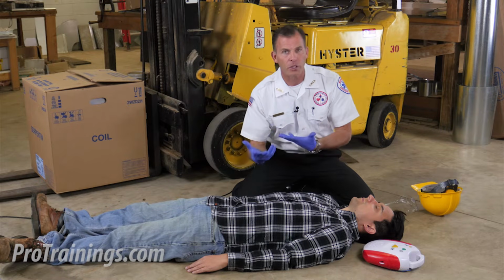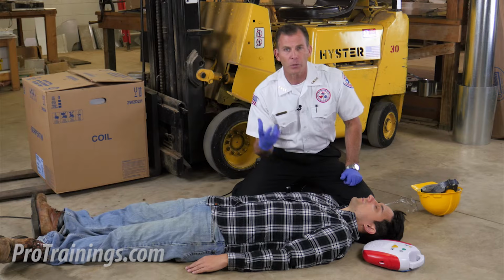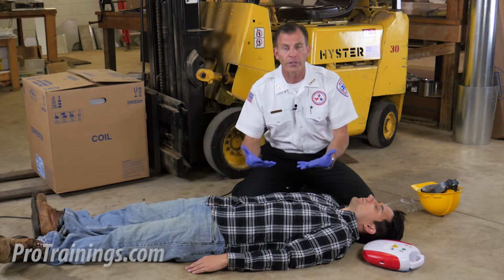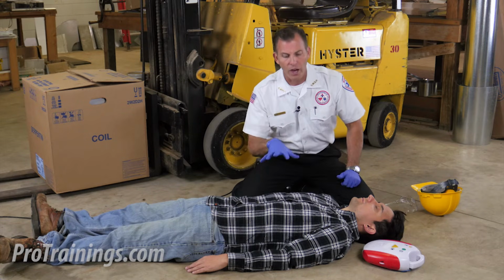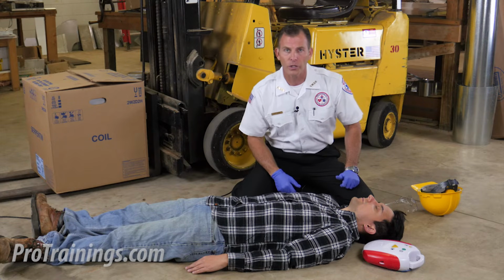They can give off a spark when it defibrillates, and if so, we don't want to have to worry about combustible gases or liquids, and we don't want the patient lying in a pool of fluids that might connect the rescuer to the patient when we defibrillate. So as long as the scene does not have that in the environment, we're good to go. Now let's get started with the scenario.